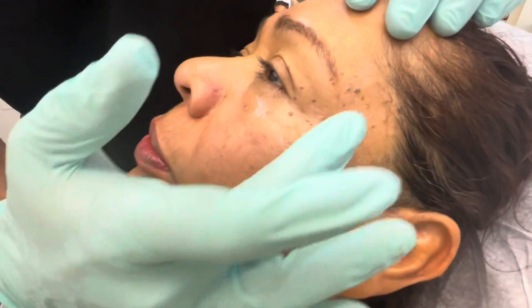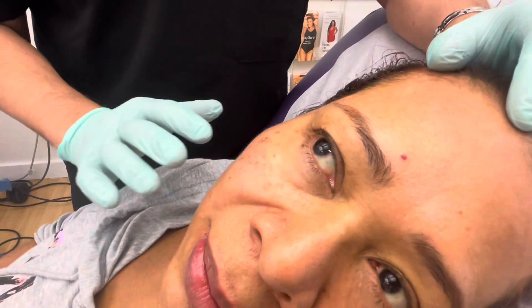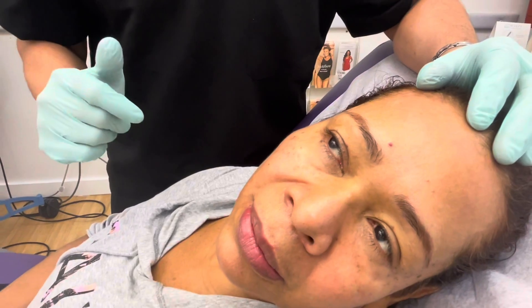With radiofrequency, we're going to remove all this. It'll be healing within a week or so, and we'll show you before and after as she comes back with final results.